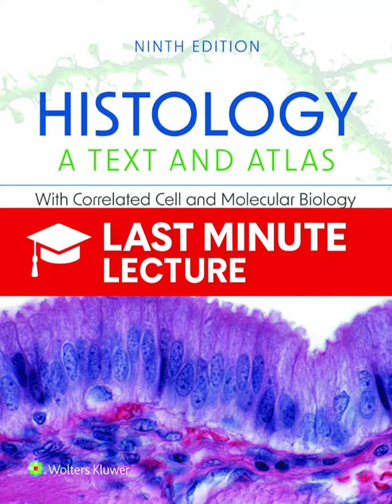The advantages are immense. You get remote viewing on any device, seamless zooming from low to high power without changing lenses, an orientation map so you never get lost, and you can make your own annotations and drawings right on the digital slide. And clinically, this drives the practice of telepathology. That's right. Virtual slides can be shared instantly anywhere in the world, allowing pathologists to render diagnoses from a distance. It's quickly becoming the new standard for tissue examination.